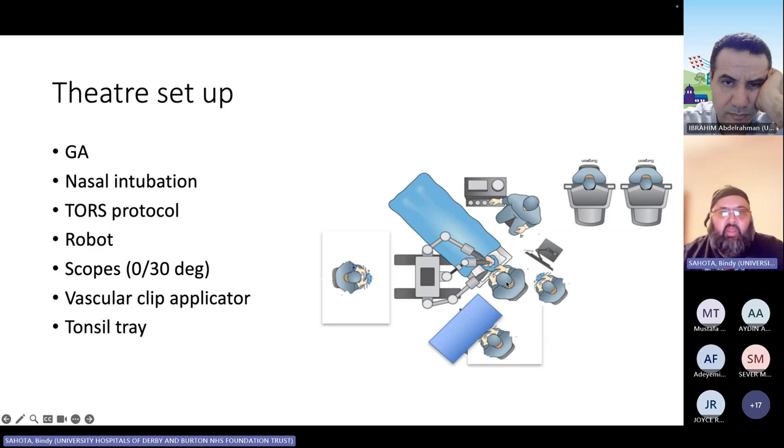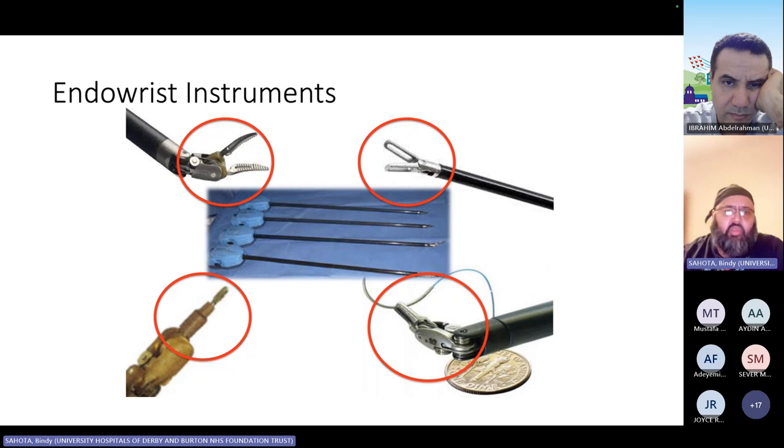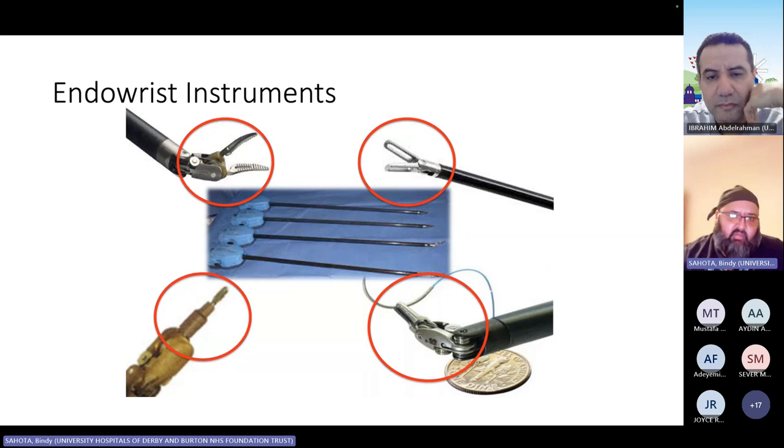We dock at a combination, so you can use either 45 degrees or 90 degrees, and we use a bit of both in our unit. We normally have a surgeon at our primary console, and then a trainee at the secondary console, so we can actually train people as we operate. The primary thing I was talking about a minute ago is that the instruments are endo-wristed, so they move like a little tiny wrist. They're not like a laparoscope where they swing. They have this arc of movement in a very fine area, and that's what it's all about.